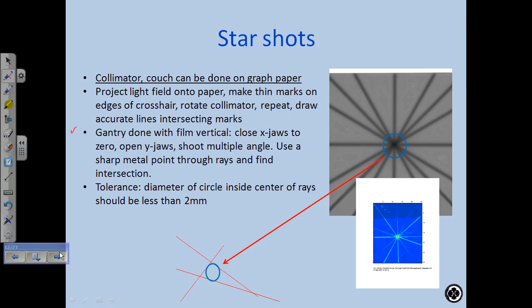And this is a zoomed up view of what's in the center, and what you're trying to do is inscribe a circle inside the little triangles when you look real close. How do you get these lines? Where do those lines come from? These red lines, are they just the rays? Yeah. If you're using RIT, it'll do it for you.